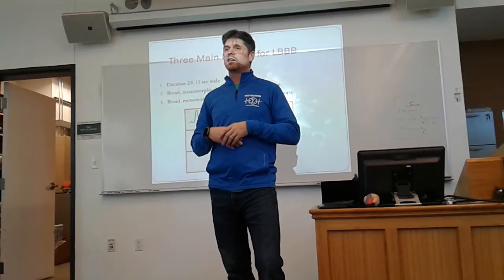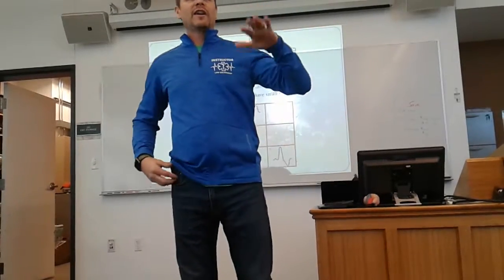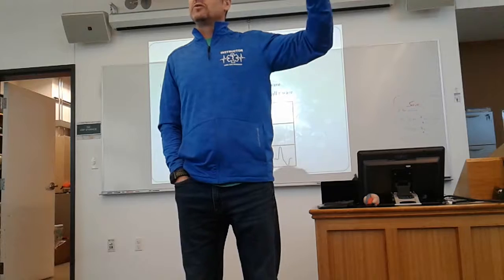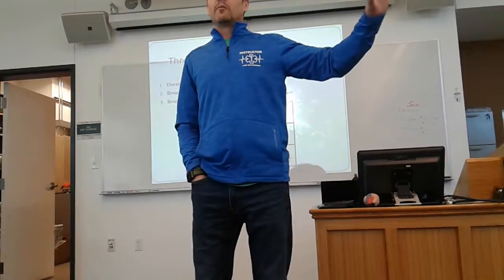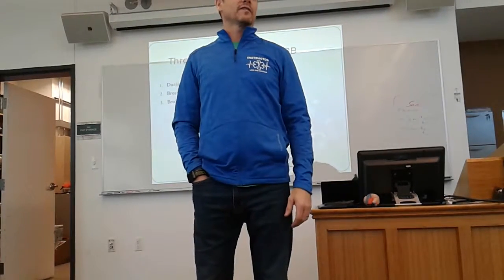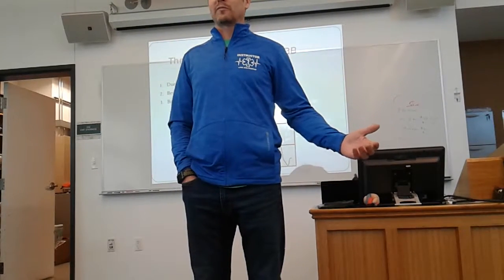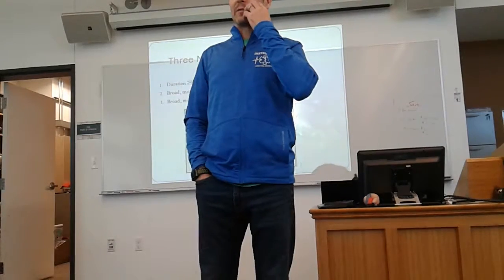So sometimes maybe you'll see a big, broad, negative wave in V1, which would lead you down the path of a left bundle branch block, but you see clear, good, slurred S waves in leads 1 and V6, which shouldn't have S waves to begin with, because they're supposed to be all positive, right? Well, that creates a little bit of a problem, doesn't it?